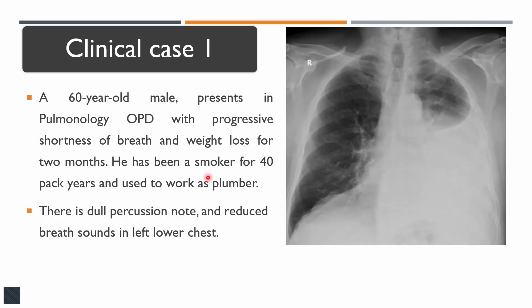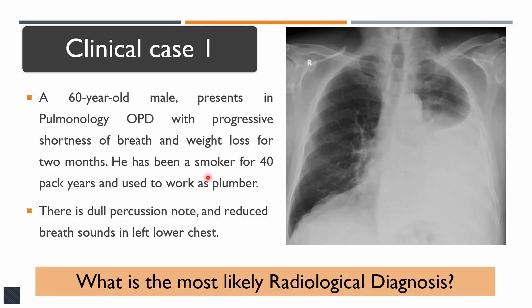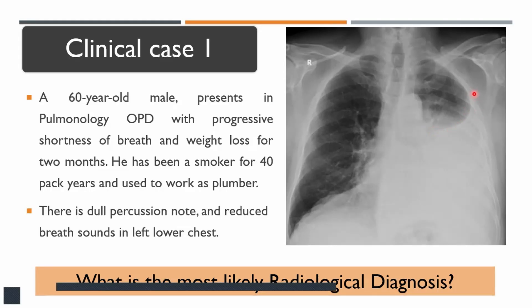This is the x-ray. What is the most likely radiological diagnosis? If you have seen my previous x-ray videos, you should be able to identify the abnormality. On the left side, there is a homogenous opacification in the left middle and lower zone. You cannot see the left diaphragm or the left heart border. The upper border of this opacification is concave with a meniscus sign, going upwards laterally along the chest wall. This is a typical finding of left-sided pleural effusion.